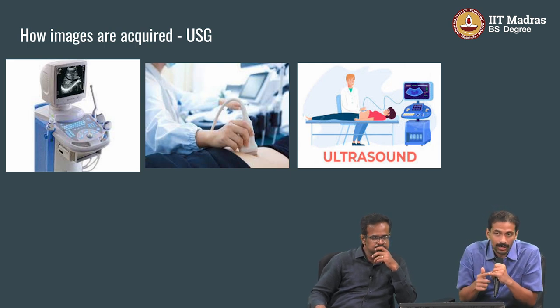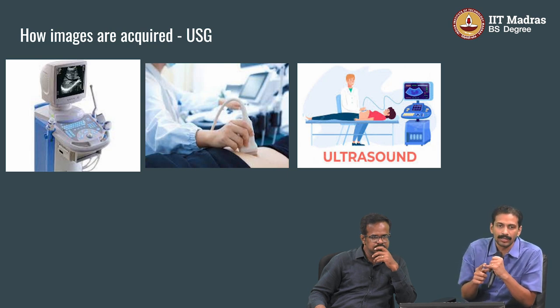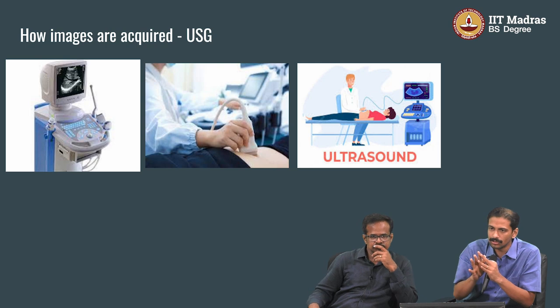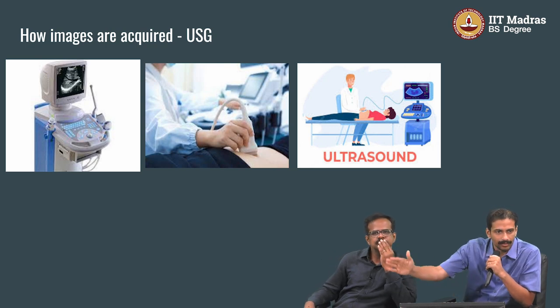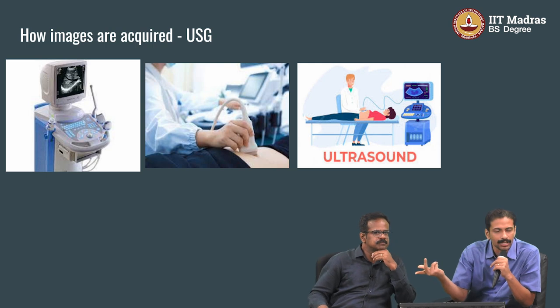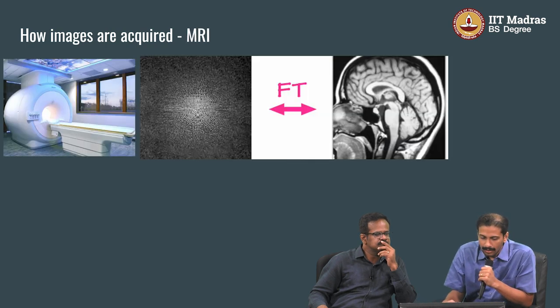It's a cross-sectional modality. But what is the benefit of ultrasound? This is not a radiation intensive modality. It is based purely on sound. It is harmless. You can do it multiple times, it doesn't matter. And it is a real-time modality. You can keep doing it and watching the movement constantly without any issue. You can capture the entire 3 minutes, 4 minutes, it doesn't matter, because there is no radiation involved. There are no harmful effects. So ultrasound has a lot of benefits. There are some issues also. I'll not highlight those.